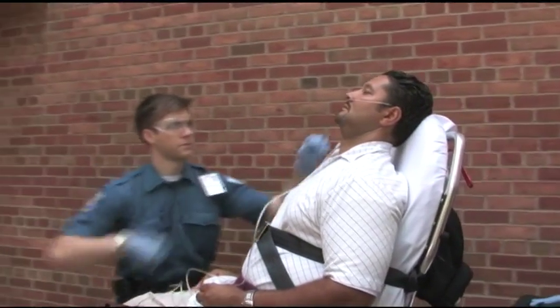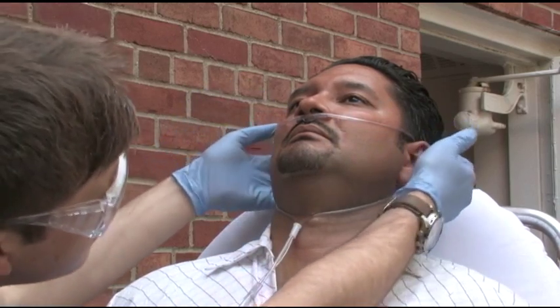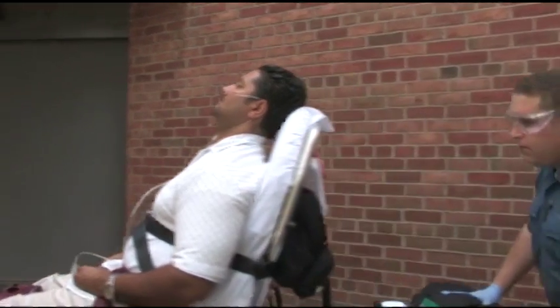Remember to check the cannula position periodically to make sure that it has not been dislodged. Caution should be used when moving a patient with a nasal cannula, as nasal trauma can occur.